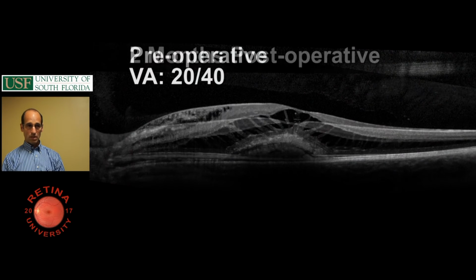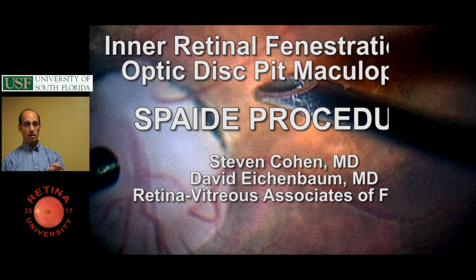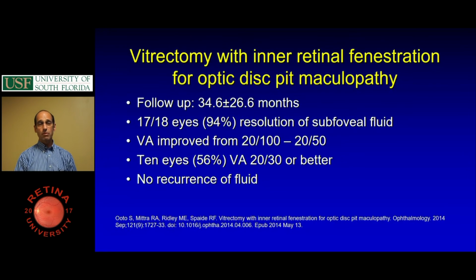And both of these patients did well. So this was the patient with the subretinal fluid, and then it goes away, and then it's gone. What's amazing is you can't really... How deep do you think you were? Do you have any idea? Not very. Not much. You just kind of move in the retina. And that's why you got to see if you're even hitting it.